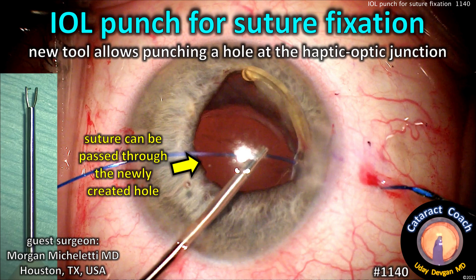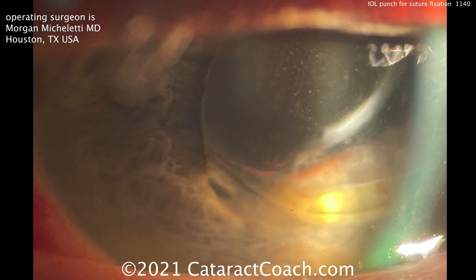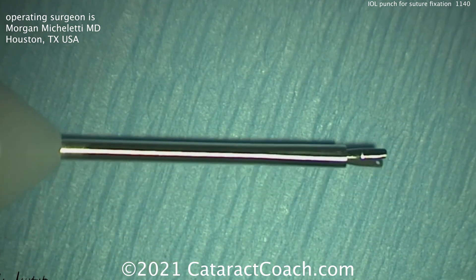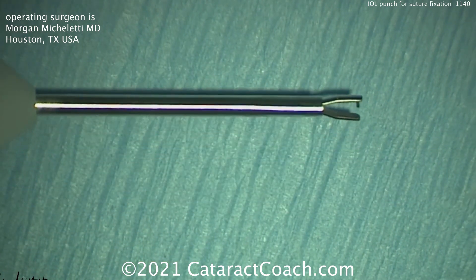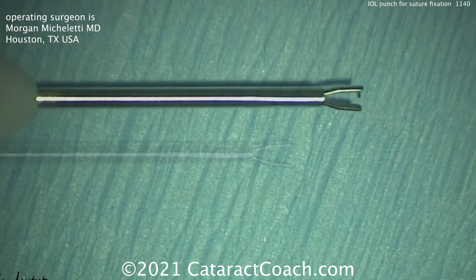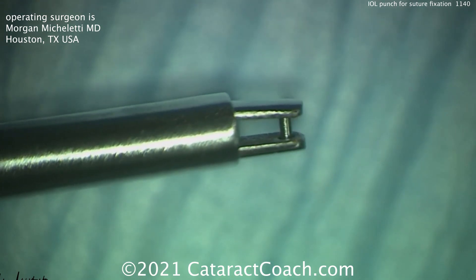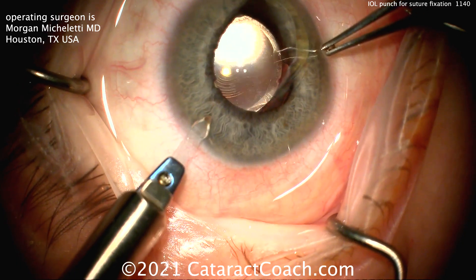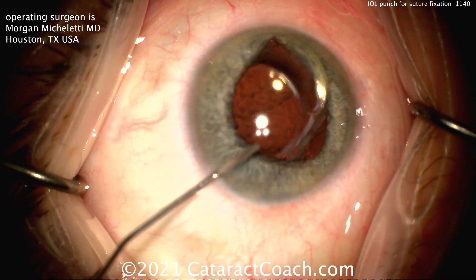From cataractcoach.com: the Eye Well Punch for suture fixation — this is a new tool. Here's a patient with a dislocated single-piece acrylic lens, with the haptic in the anterior chamber. This is the tool designed by Morgan Michelletti from Houston, Texas — a punch that allows you to punch a hole in the haptic-optic junction of a single-piece acrylic lens.